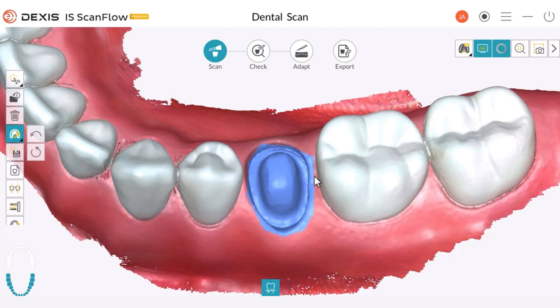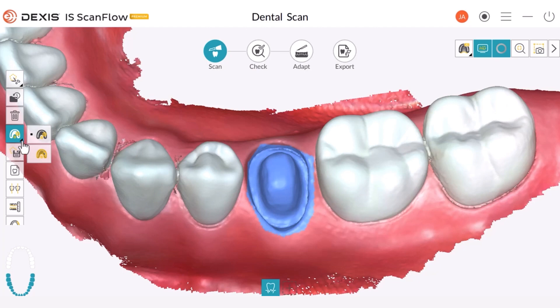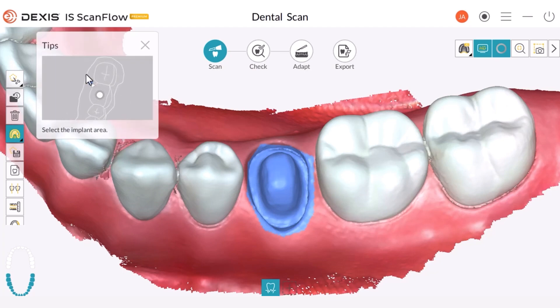Now let's explore another interesting option related to the lock tool known as reverse lock. This option gives you the ability to select the area you do not want to lock out. If you do not see the tool you are looking for, left click on the triangle in the corner of the button. Once we engage the reverse lock, the tool tips window appears to show us how to use that tool, as long as the option is enabled in Preferences.